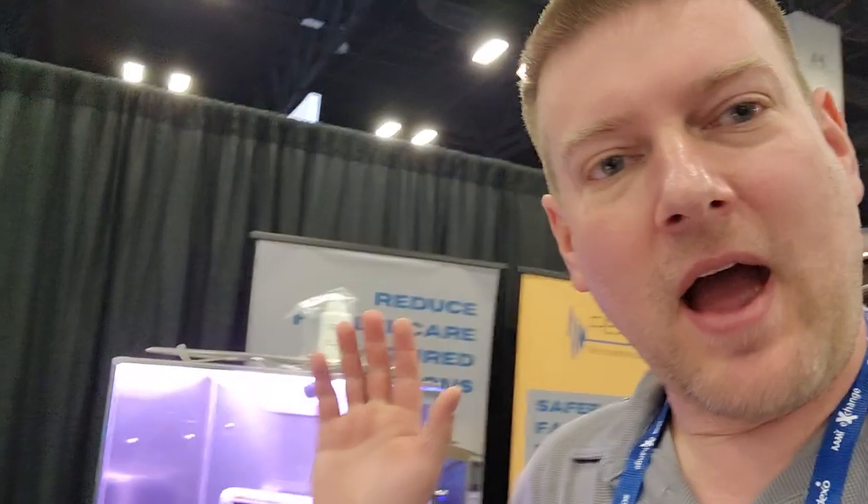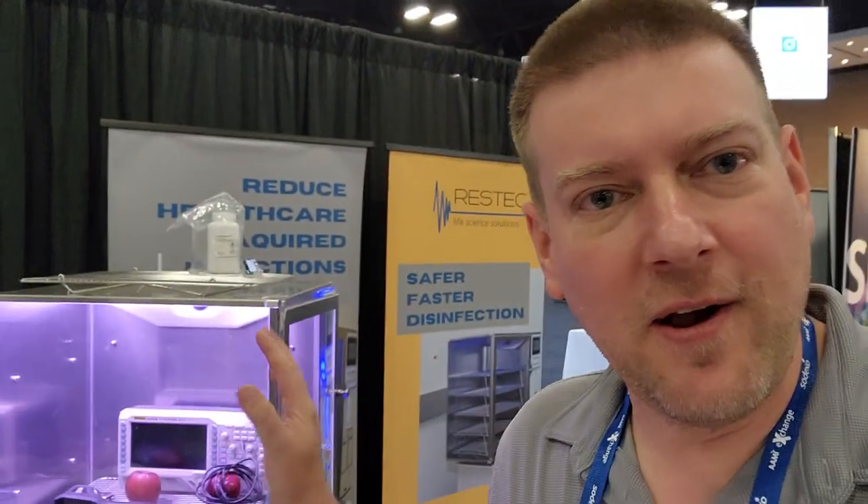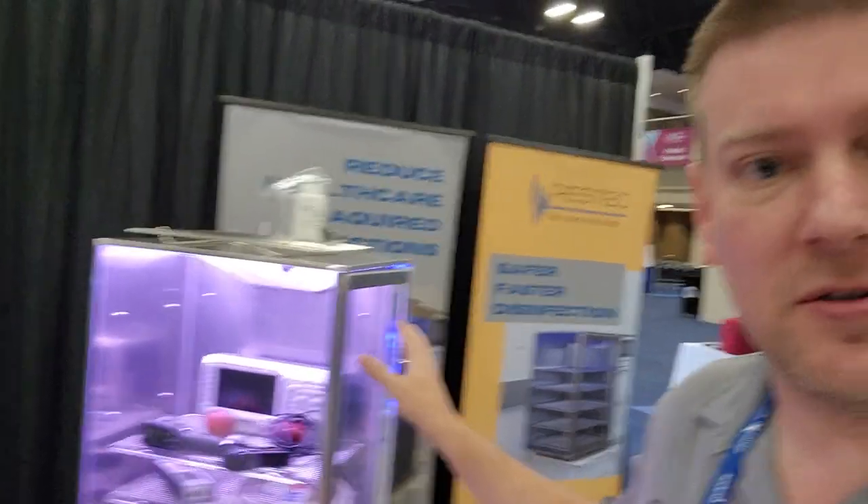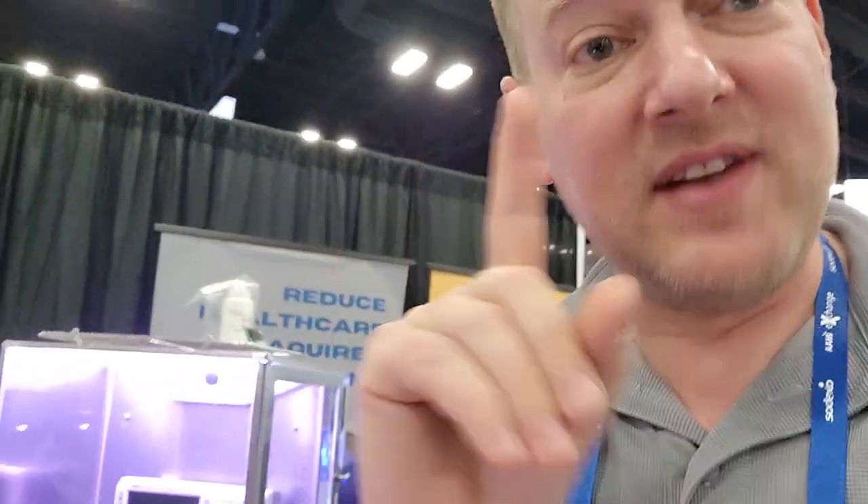Hey guys, I was walking through yesterday and caught this device on video. I didn't completely know what I was looking at. Judging by the looks, you would naturally assume this is a UV cabinet, but it's not. I knew it was some sort of sterilization, but it is not a UV cabinet — it's better.